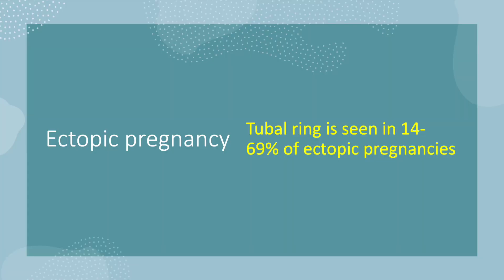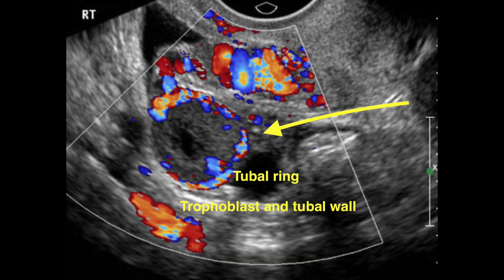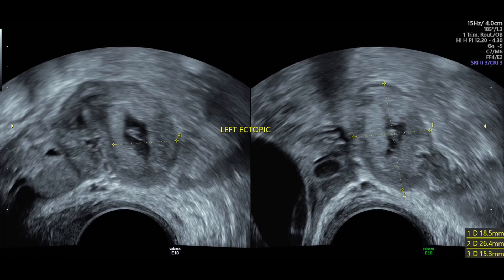The tubal ring is seen in 14-69% of all ectopic pregnancies, as shown in this picture, with a rich vascular supply in the periphery of the gestational sac.